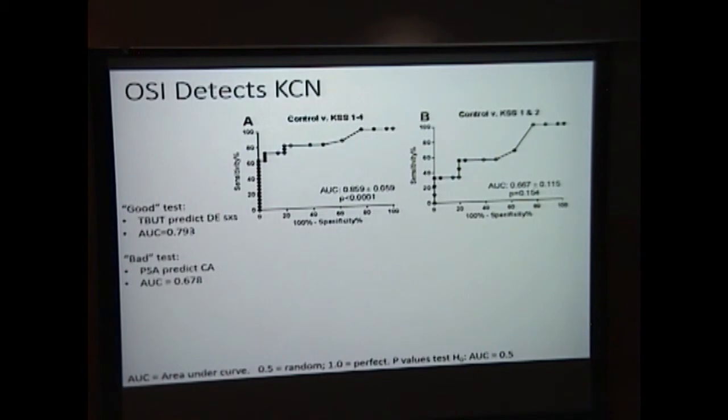Yes, they've done those studies in the past. Pablo Artal is one of the developers of this technology. Dr. Waring was actually just at his lab yesterday. They have done a lot of the studies which give those relative correlations of OSI values with BCVA. They haven't looked at it specifically in keratoconus, but they have looked at it extensively with lens opacity.